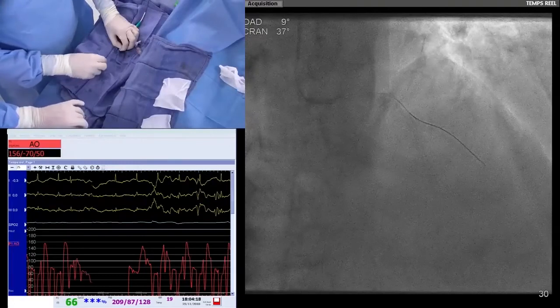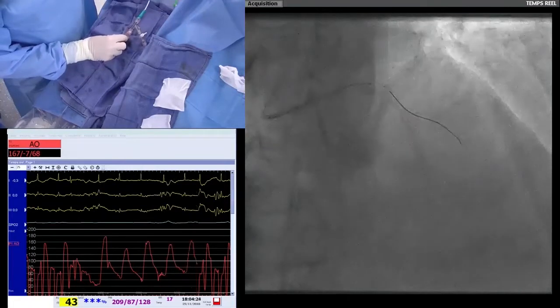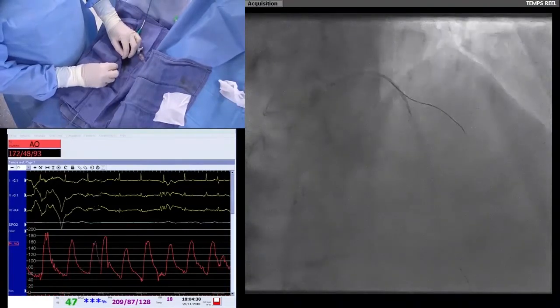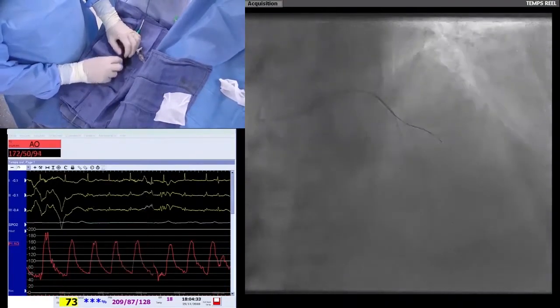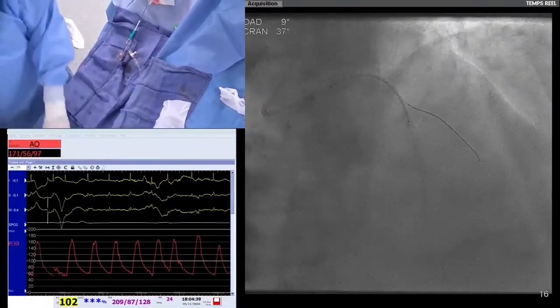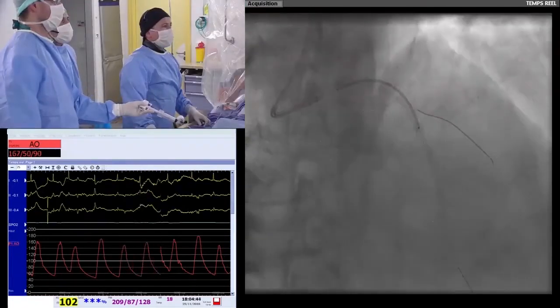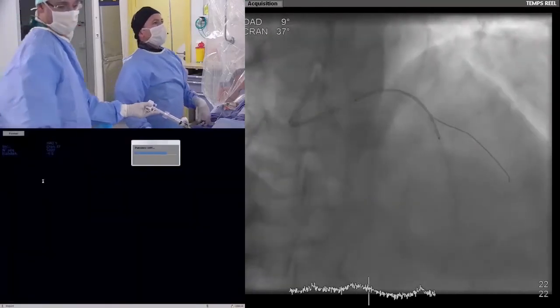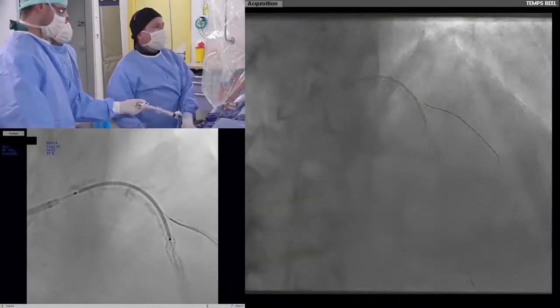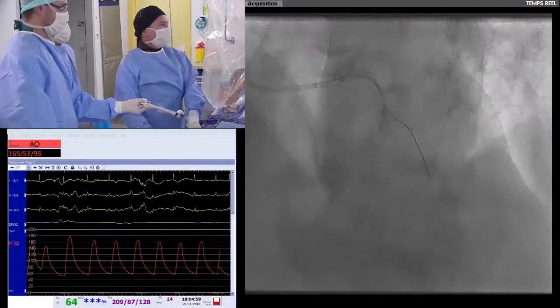To better place the stent, I can use stent boost. I think it is not so bad. Okay, stent boost. Okay. According to the calcification, we are not so bad. We will assess at this time. The pressure is good, and we will assess if we cover the left main.